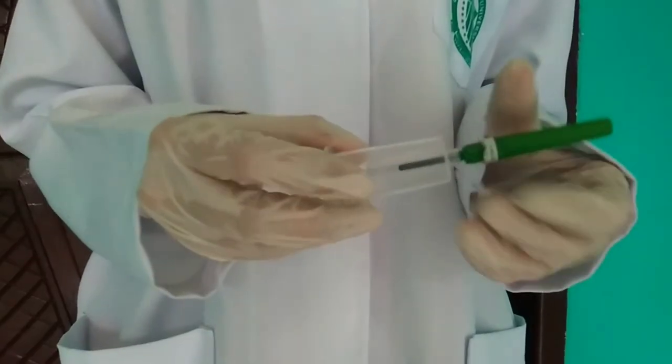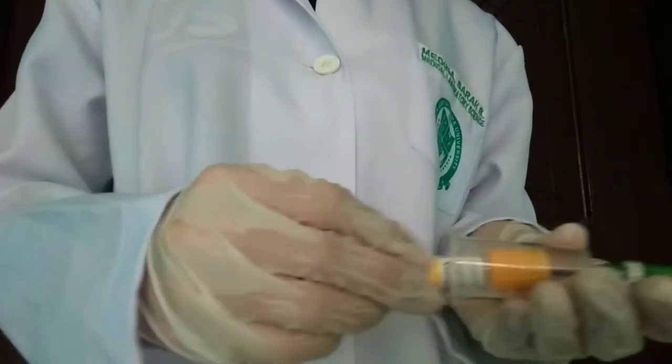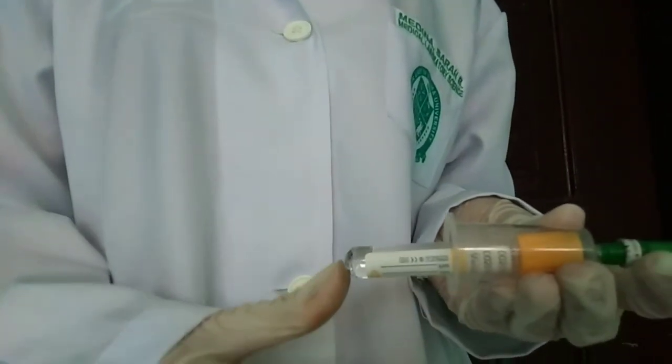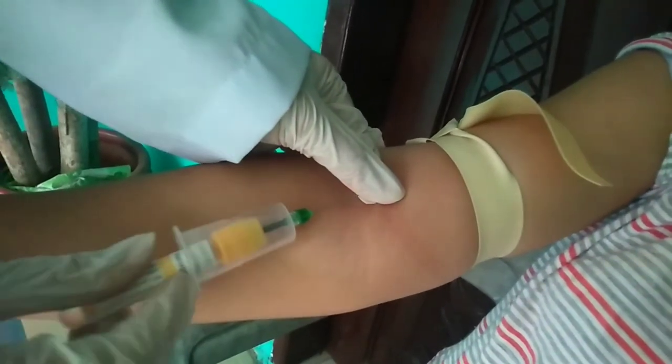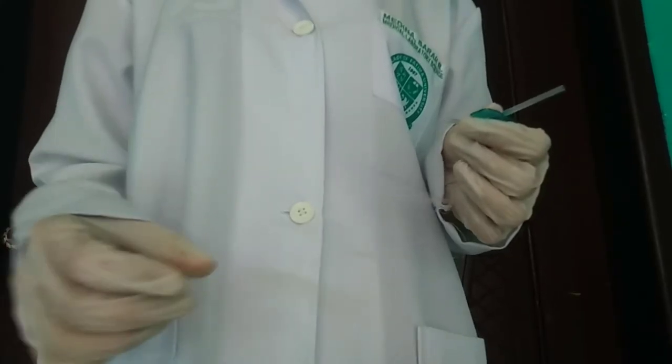Vacutainers allow multiple tubes to be collected in a single venipuncture. They have a double-pointed needle and a threaded part that screws into the holder. Vacutainers are designed to draw an exact volume of blood. Once the vein is anchored and the needle is inserted, the vacutainer tube is depressed into the needle to begin drawing blood.